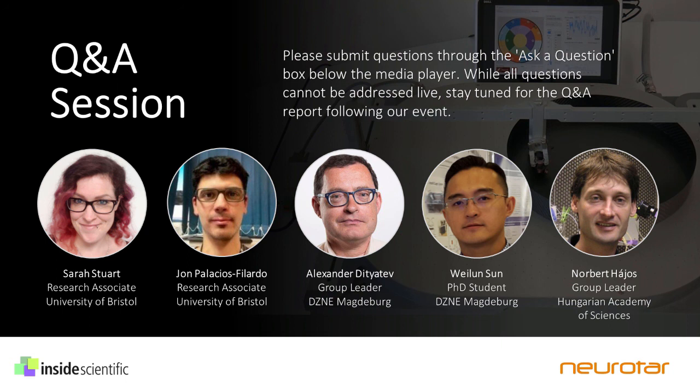That's why it's always recommended to train the mice beforehand to avoid any abrupt movements. Overall, I would say that a good 10 minutes can be expected from a trained mouse, but this is very variable and might go from 5 to 20 minutes.